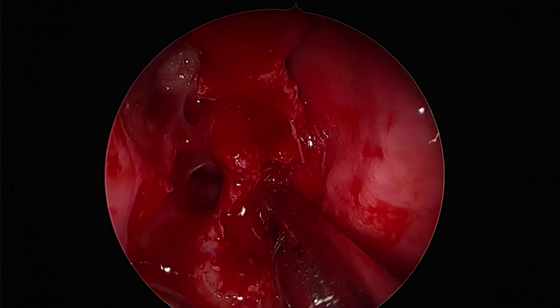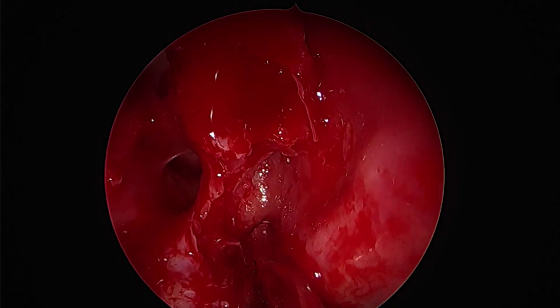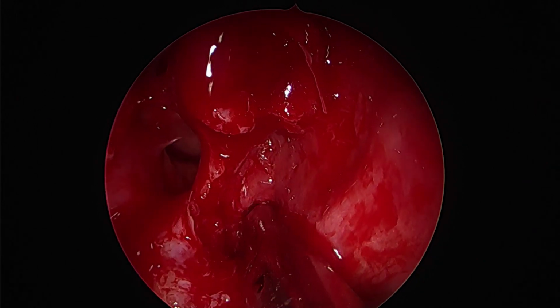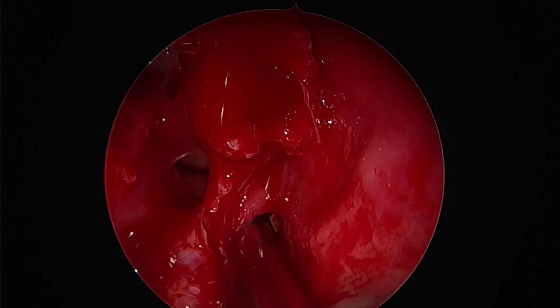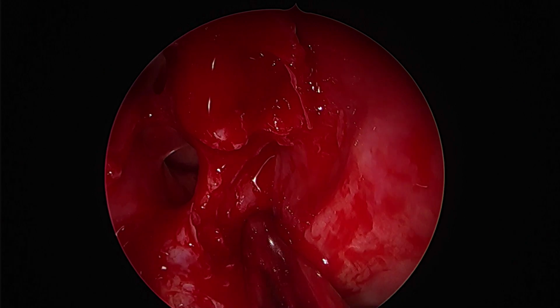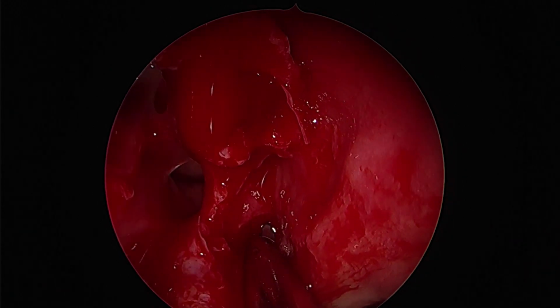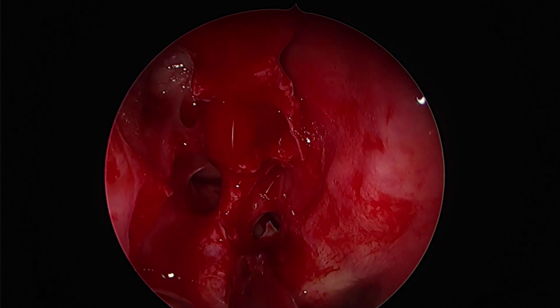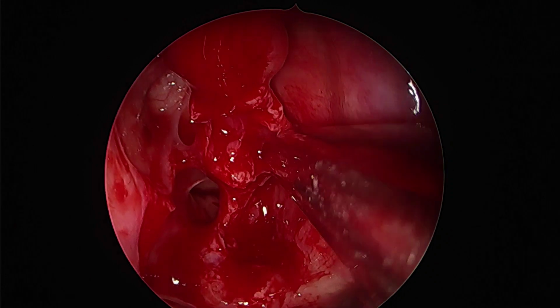Now we can see that we are trying to identify the sphenoid os, and since we do not want to puncture the Onodi cell just as yet, we want to identify it as low as possible. Already the sphenoid sinus is small as compared to the Onodi cell, which is rather big. So we take our shaver blade, we follow the choanal arch, and we gently puncture it without using undue force to give us an entry into the sphenoid os. We can see that we have found the sphenoid os.